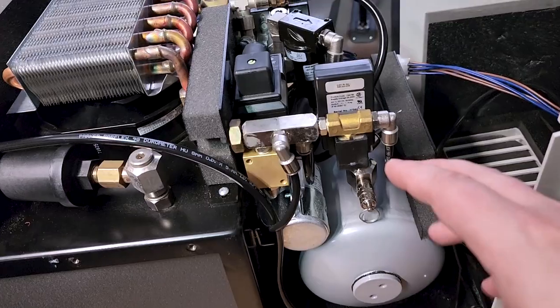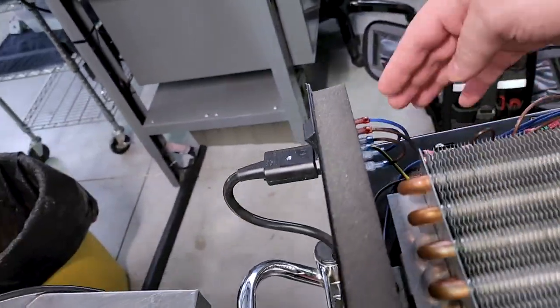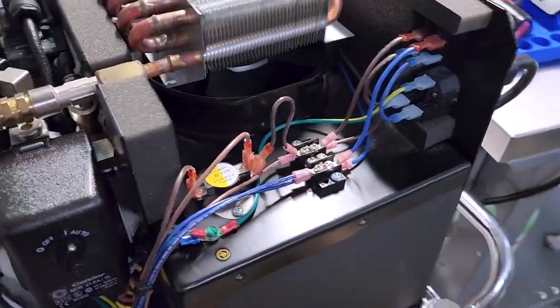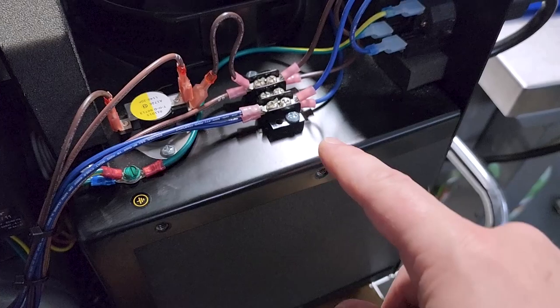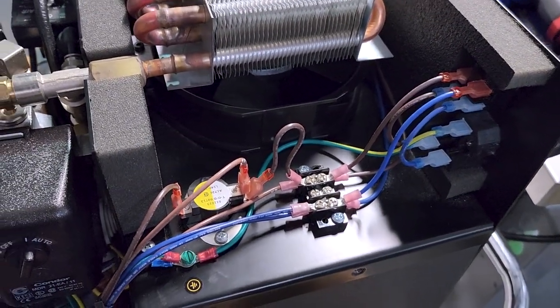So the real layout for this guy, let's see. Well, let's go ahead and start from the IEC on this side. And it's really nicely laid out. European wiring code. You can see the brown and the blue. Brown is the hot. And an open terminal block right here. So watch yourselves if you ever open these, because it does have exposed connections.